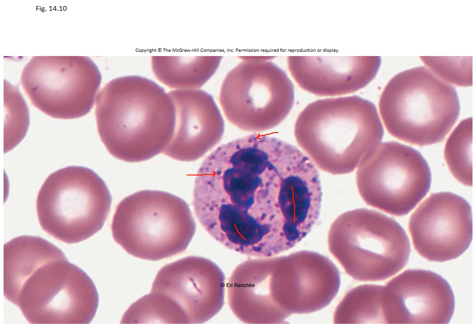To me, this looks like if you went to a carnival as a kid and you got a little balloon animal and you thought it was cool and you left it up on your desk and it started to inflate or deflate and it starts looking all weird. That's what I think this looks like. But that is the key to the neutrophil. It is going to have multi-lobes, at least three on any picture I'm going to give you, of a weird shaped nucleus.